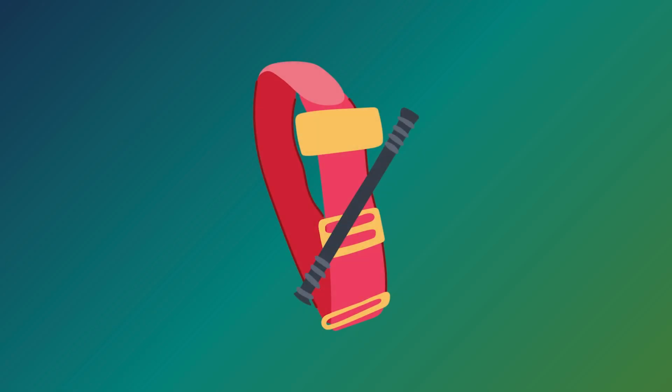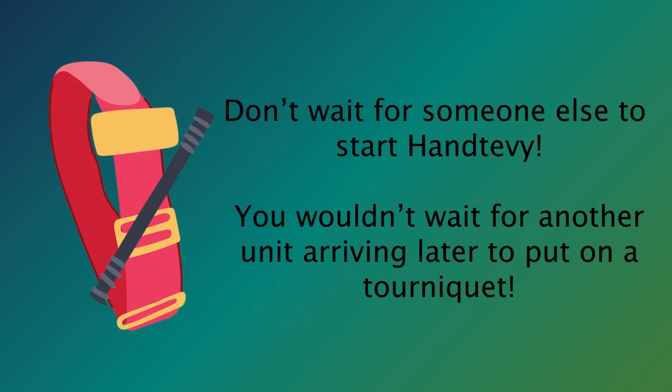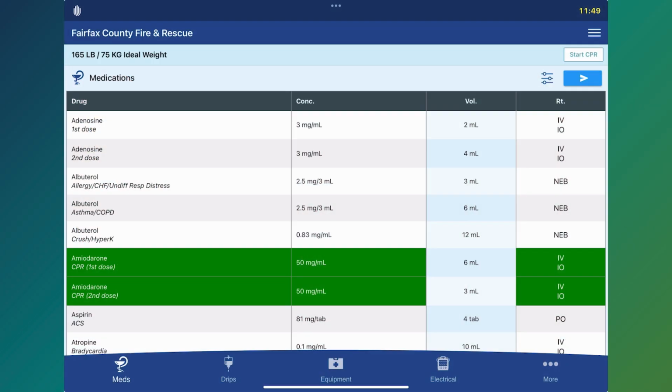Think of it like a tourniquet. Once it's on the patient, it stays on. You wouldn't take off a tourniquet someone else put on just to put your own on. Right? Okay, moving on now.